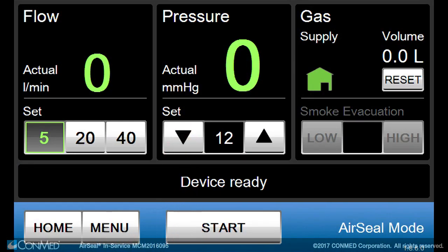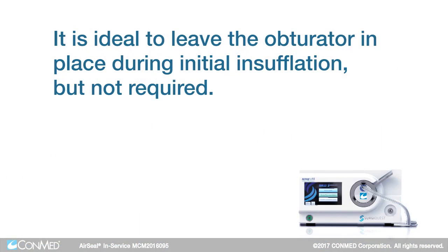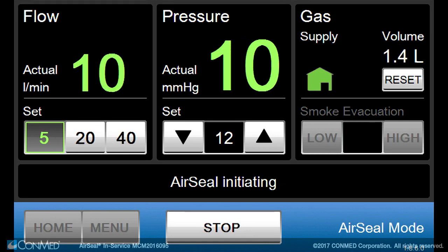Set the desired flow rate and pressure value. Press start on the IFS screen. It's ideal to leave the obturator in place during initial insufflation, but not required. Wait until proper abdominal pressure is achieved.